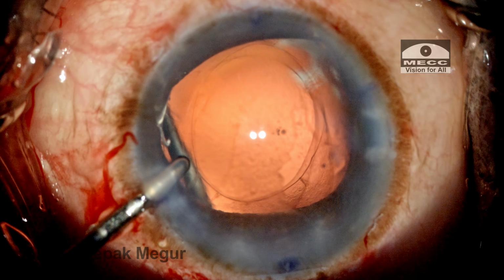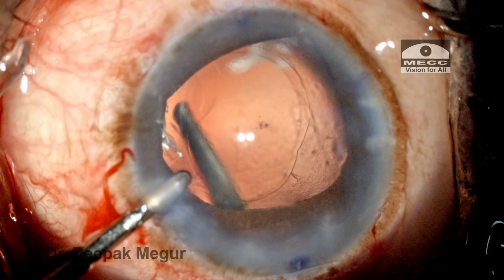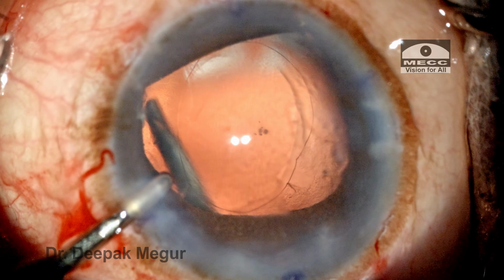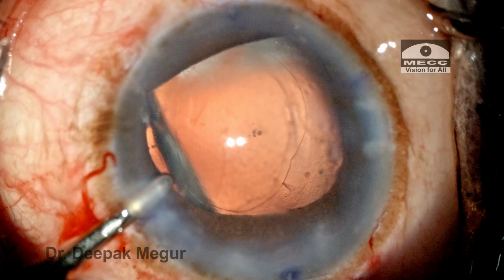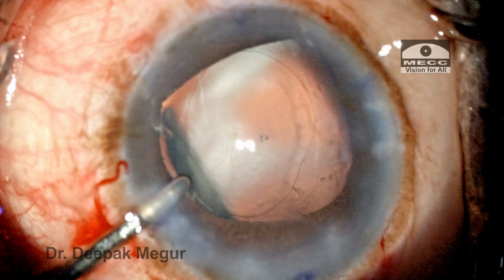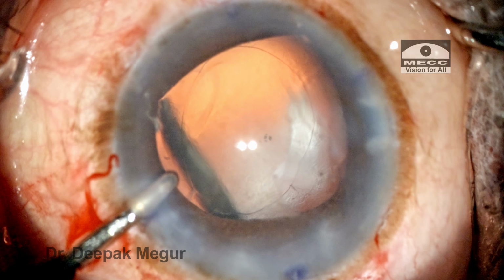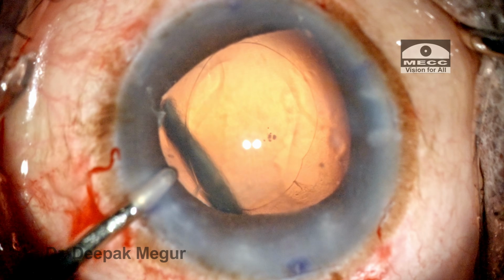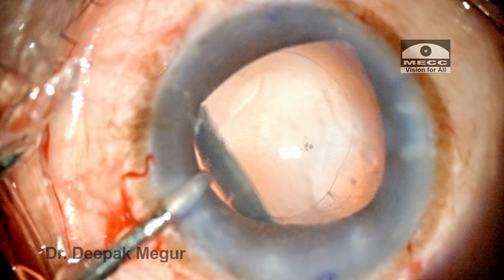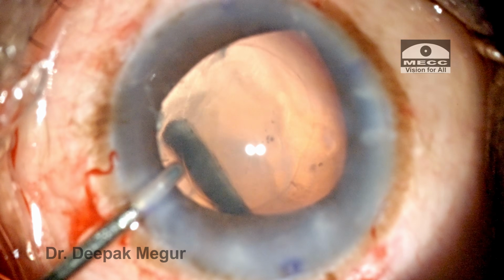When you're trying to do an anterior vitrectomy through the pars plana approach, we need to remember what can go wrong. The most unwanted complication would be the PC tear. The vitrector can inadvertently catch the posterior capsule and tear it. This can happen especially for anterior segment surgeons, because we are not used to the pars plana approach and our depth assessment might not be great. So inadvertently, there's always a risk of the cutter chewing on the posterior capsule. So I need to be mindful and to keep a safe distance away from the posterior capsule.